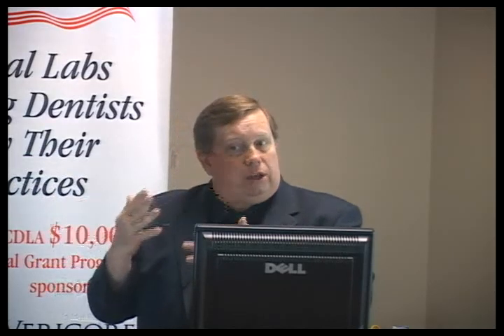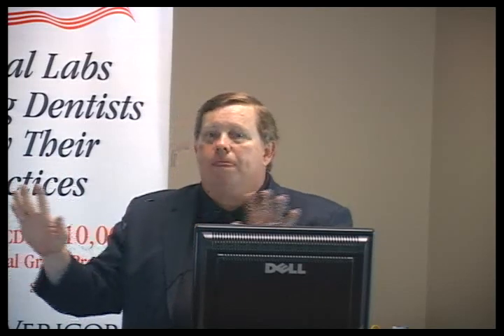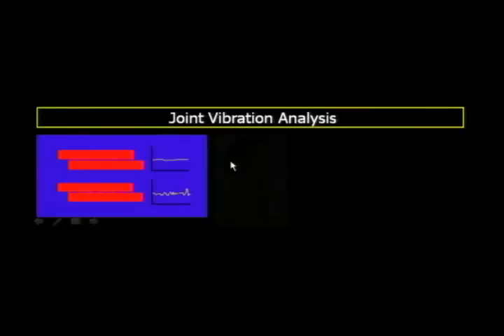That's it. You can do the same thing with a stethoscope, but with a Doppler, the patient can hear. So it allows you to have the conversation with the patient about what's going on not only on the medial pole, but the lateral pole as well, because more likely that's where you're going to hear noise. But Doppler, again, is a great tool, but it doesn't definitively diagnose joints.